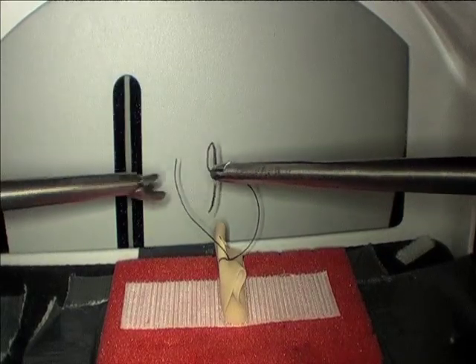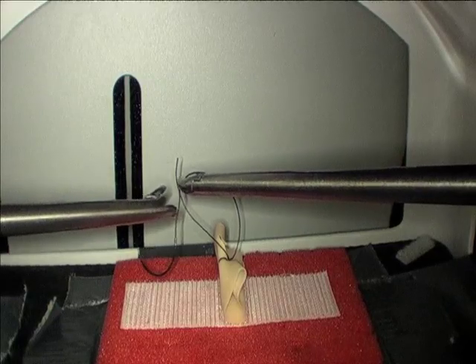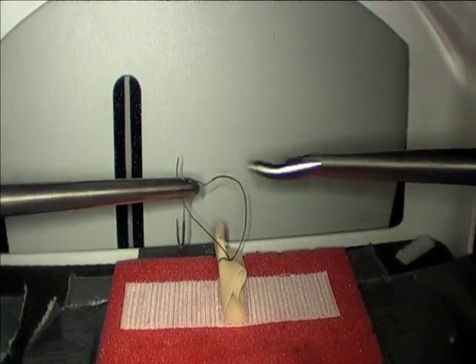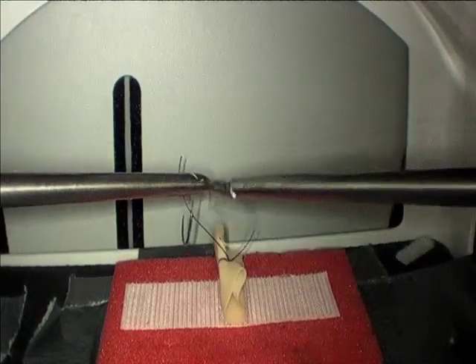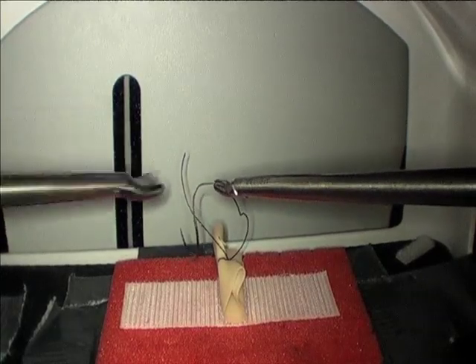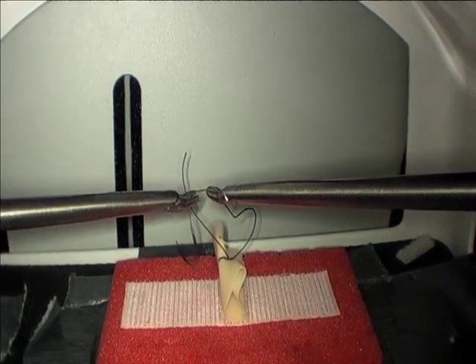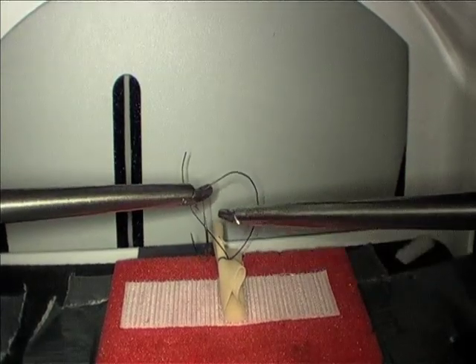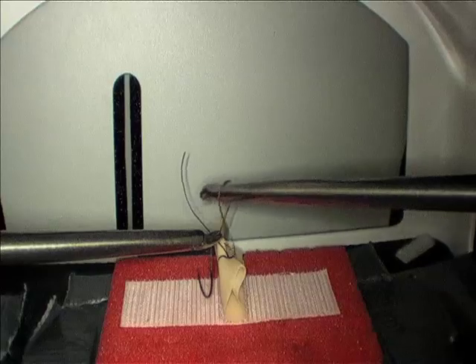A common error is to grab the suture such that it is coming out of the back of the needle driver instead of the tips. This makes it much harder to set up your loop and much harder to bring your needle driver around. Instead, grab the suture with the tip of your needle driver so that the suture is coming out of the tips, making it easy to set up a C loop so that you can come over the top and grab your suture tail.